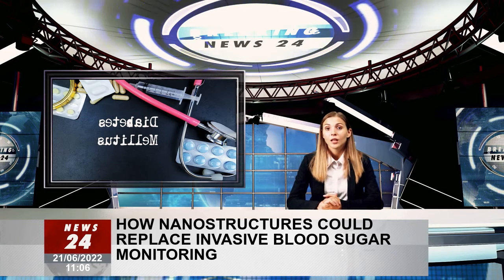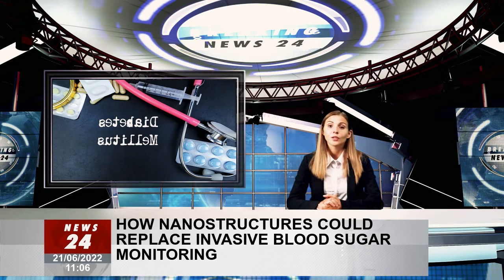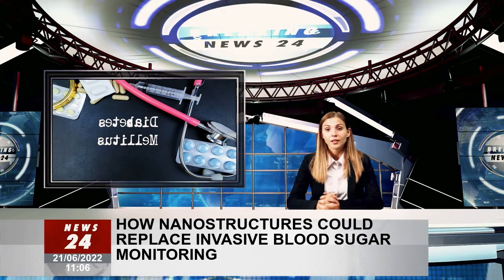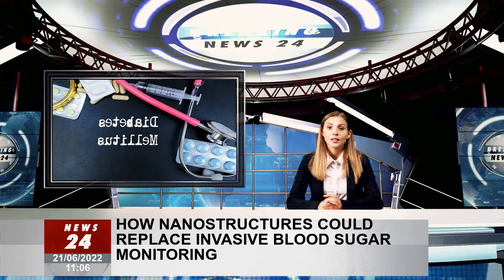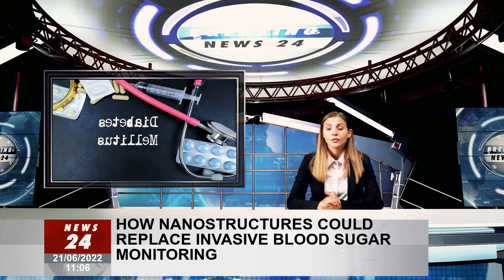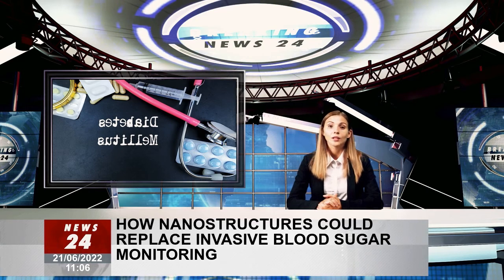Breath evaluation is an innovative and evolving procedure that capitalizes on the advances of contemporary measurement technology. It is a non-invasive method to evaluate expelled breath elements to help diagnose diseases, for therapeutic evaluation, and for metabolic monitoring. Why is it important to measure acetone in breathing?